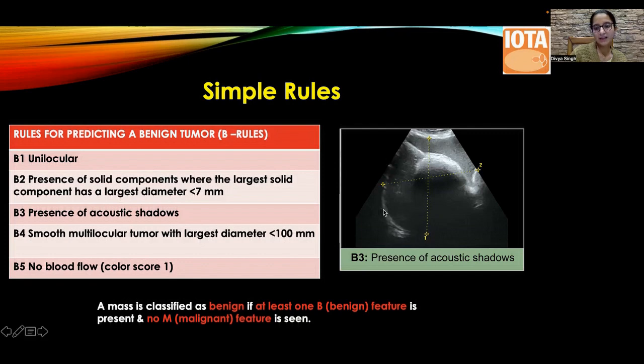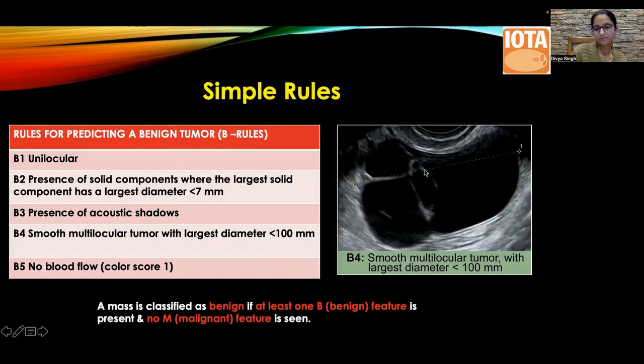So this is the entire lesion, and you can appreciate it has an echogenic component with dense posterior shadowing. There are other mixed echogenicity areas. So this is typical of an ovarian dermoid. Then this is what a multilocular lesion looks like. You see multiple septations, which will be complete in all planes.